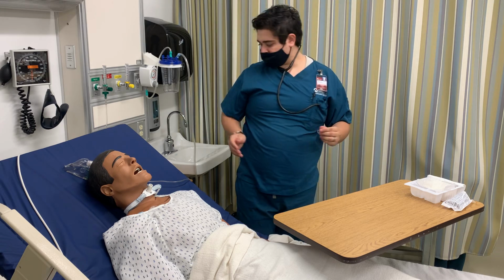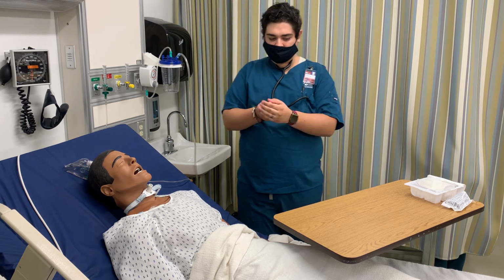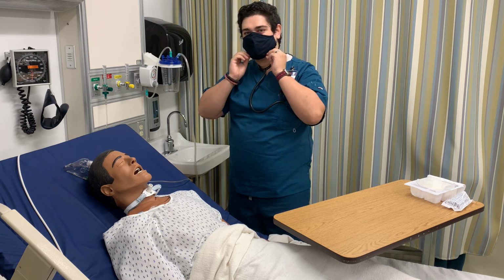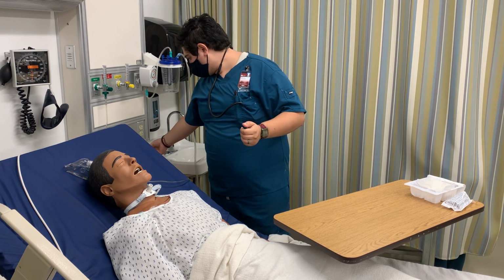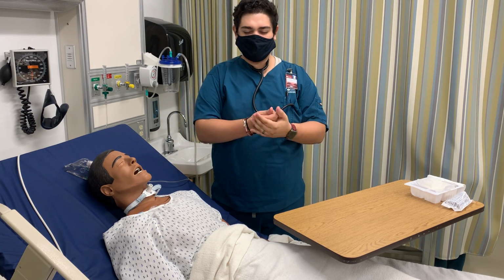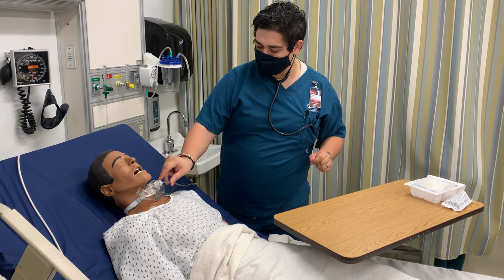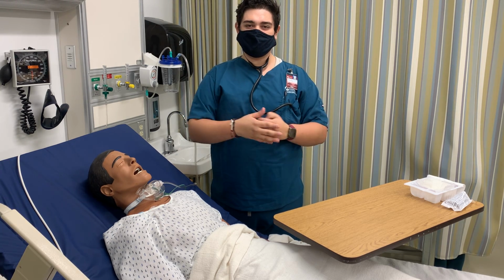Okay. Perform hand hygiene. Sorry, try to fix my mask. Perform hand hygiene. While I'm doing this, I will also monitor signs for hypoxemia. I will replace his oxygen, making sure that he has a few minutes to rest because of the suctioning.